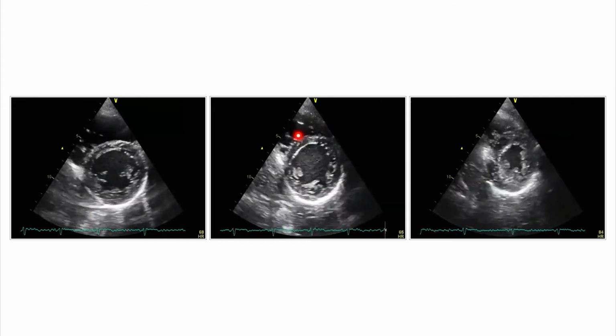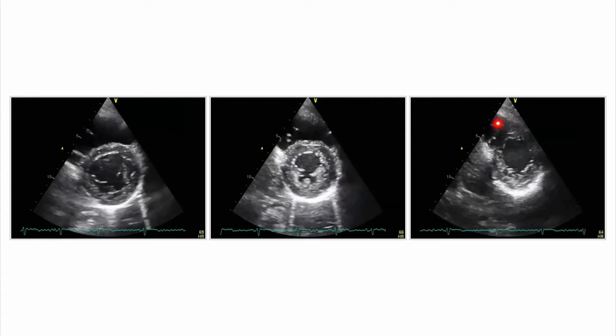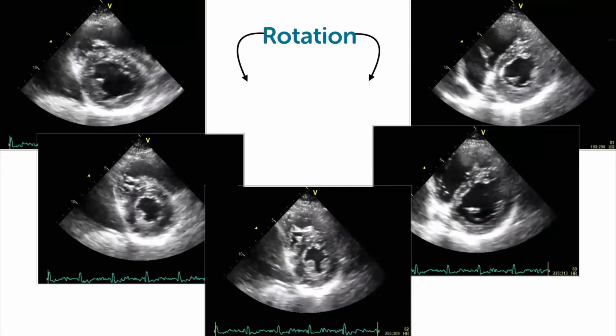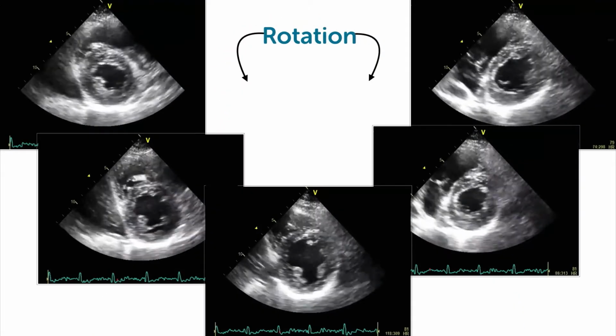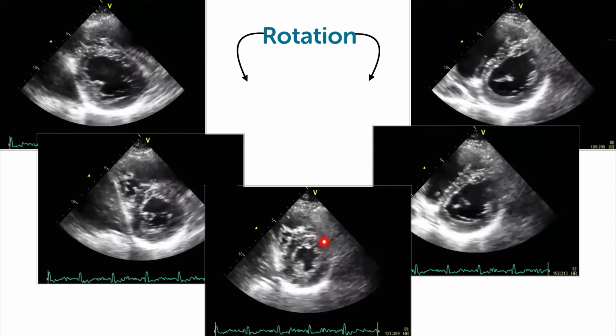The right ventricle gets smaller, and if I put the transducer relatively close to the apex, the right ventricle will be very, very small. So keep that in mind as well. And if we now come back to the rotation, let's show the same thing we did for the short axis view at the base. Here is the ventricle in the middle. This is the optimal view.